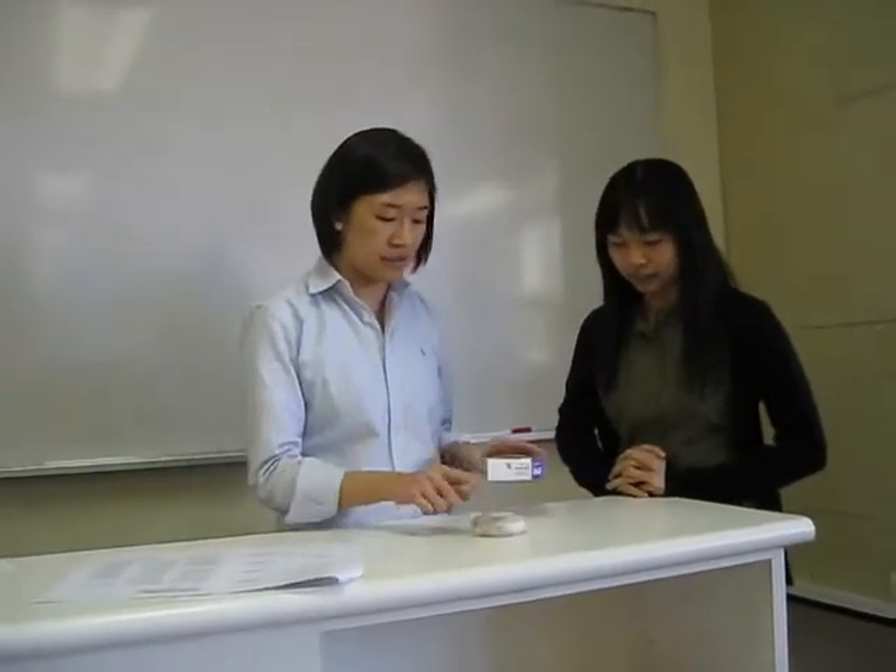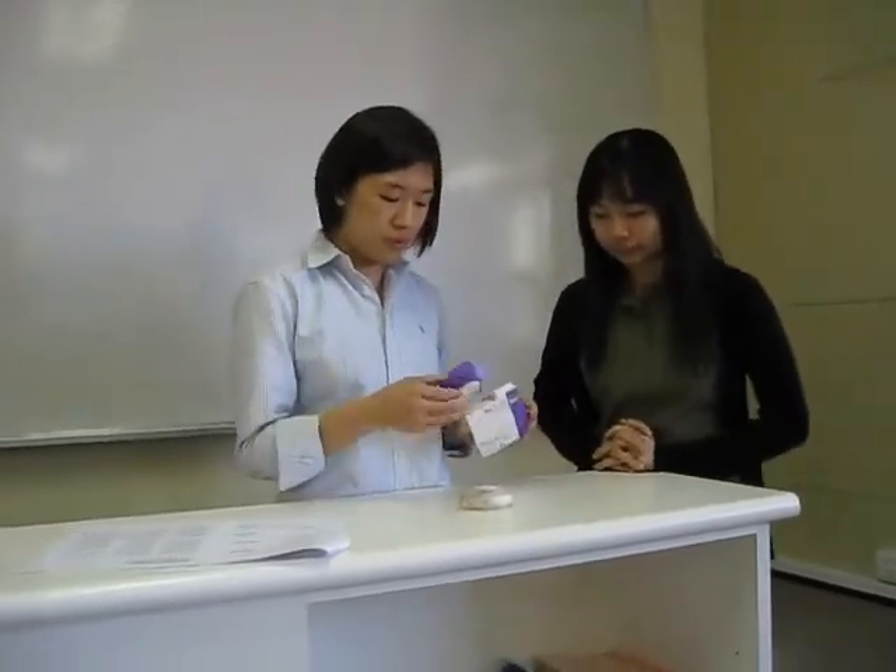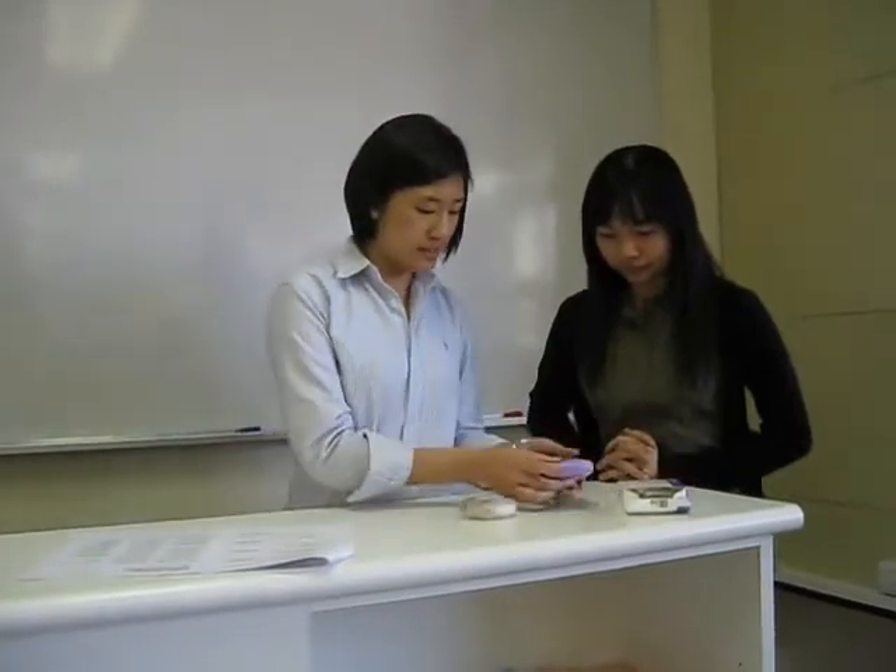I think it's for my asthma. Yeah, it's for your asthma for long-term control of your symptoms. It helps you in the long-term. I think you haven't used it before, right? No. Maybe I can show you. Is it very different from the Ventolin that I've been using? Yeah, it's quite different. The device is different. This is the tester. Maybe I can use this one to show you. But the actual one is like this.